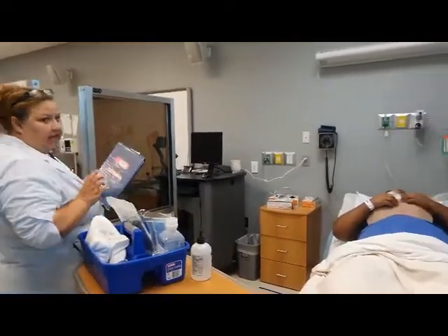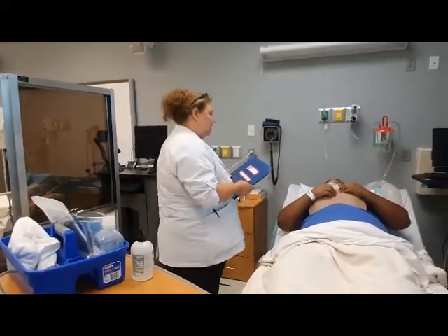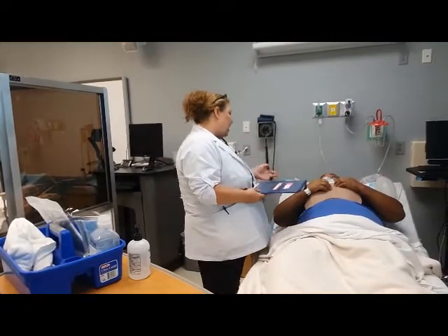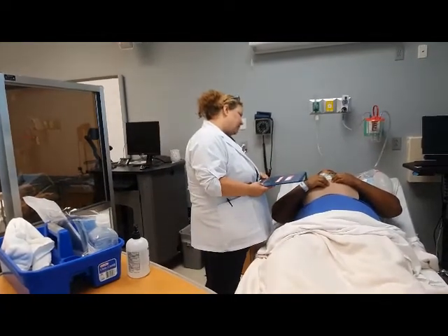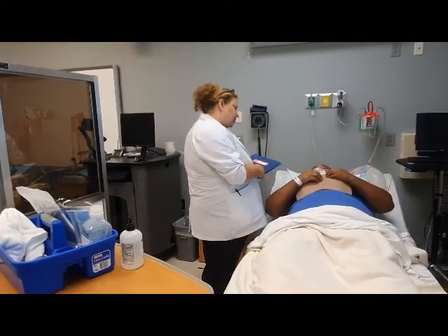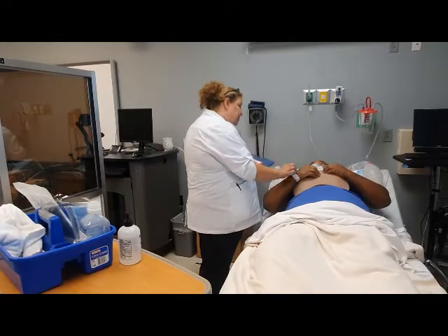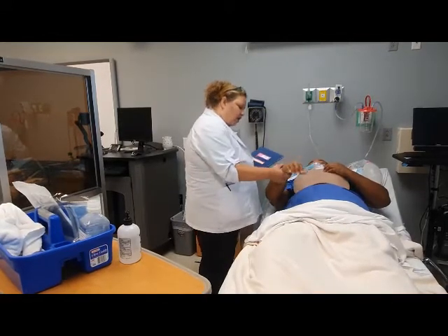So that's when you're going to take the chart to the bedside and knock on the door. Hello, I am Christy. I'm going to be your nurse today. We are needing to do some suctioning on you. The doctor has ordered it, plus you've got a lot of secretions in there. So I just need to check and make sure that you are who you are.